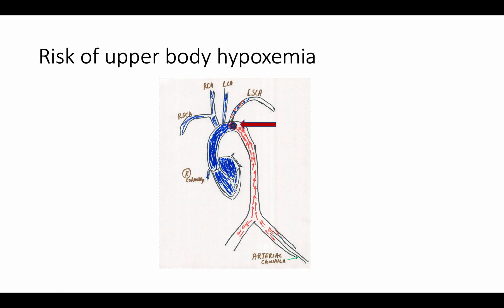and so on. Gas exchange in the lungs may be severely impaired, especially if rest setting is used, which may promote atelectasis. Even on high ECMO flows, a small proportion of cardiac output goes through the heart, especially if the heart can eject. Blood returning to the left side, in this case, is poorly oxygenated due to lung dysfunction and will be pumped into the aorta. This blood can preferentially flow to the coronaries and brain, impairing oxygen delivery to vital organs.